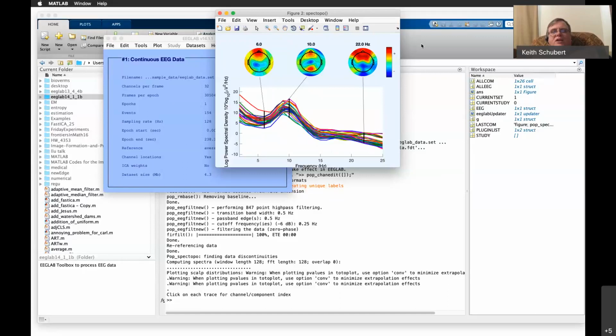Fairly intense on that. When you get to this area here and here, these are the areas of the brain typically associated with muscle planning. So somewhere right around there is kind of an intense peak. It's hard to get the exact measurements off these heads. They were already shifted a little bit. That's a little too far back. So it's kind of right here. Right about where those dark reds are is about where your muscle planning is.